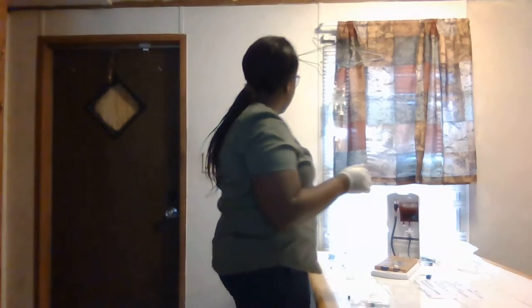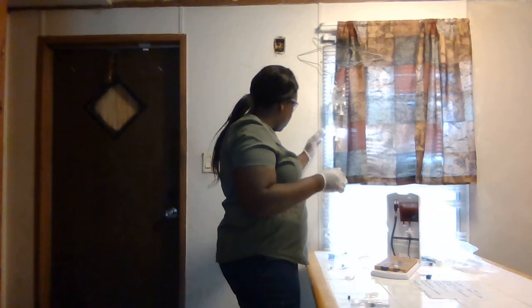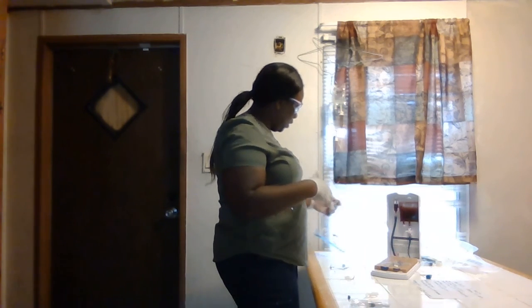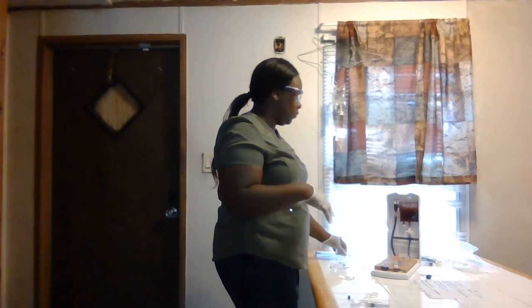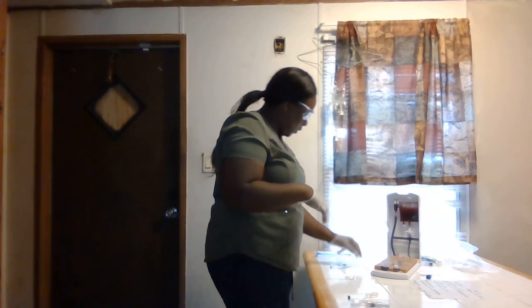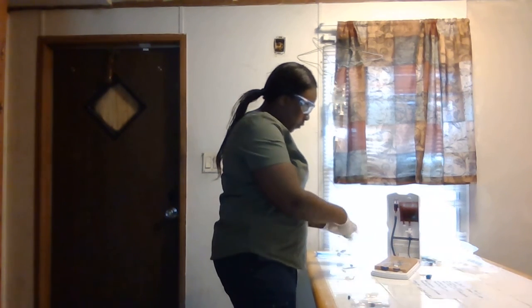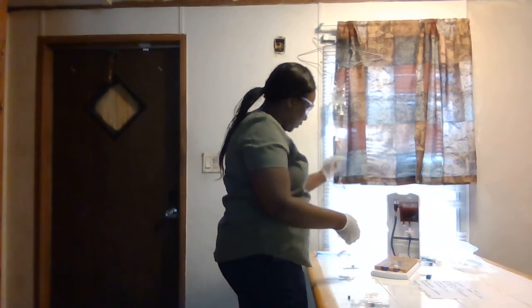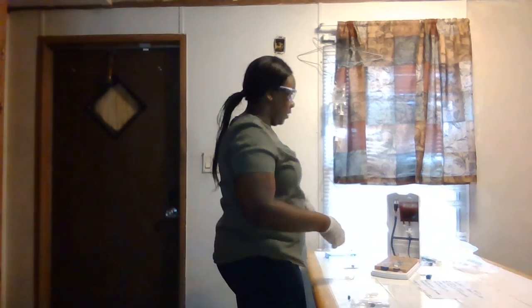It was running, I had the roller clamp on, and I'm going to turn it off. Then, because it was going at 100 the second time, I can disconnect that and trash all of that.